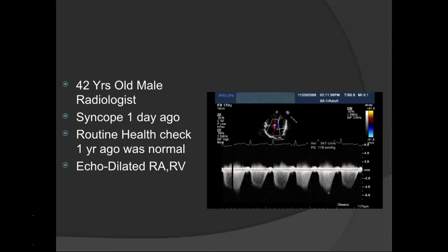So the common bottom line in our patients has been dilated RA and RV, and we have seen so many different kinds of dilated RA and RV with varying kinds of diagnosis. The useful concept is to look at the history always, have the background, and then let your mind think into the various DDs. Start with the commonest possibility, left heart disease, then think of the rare possibilities like Uhl's anomaly.